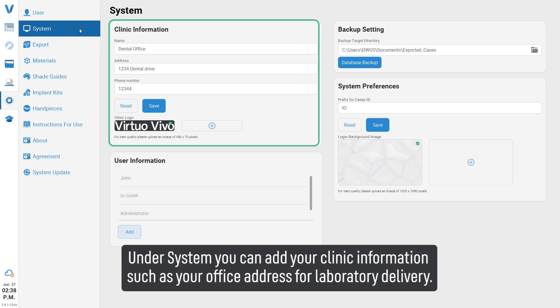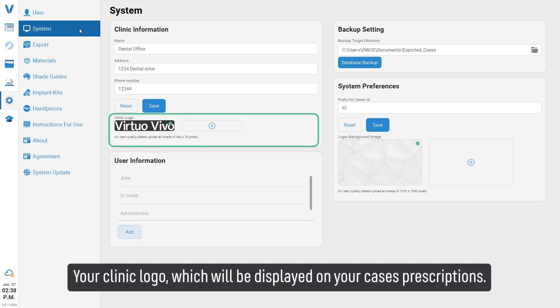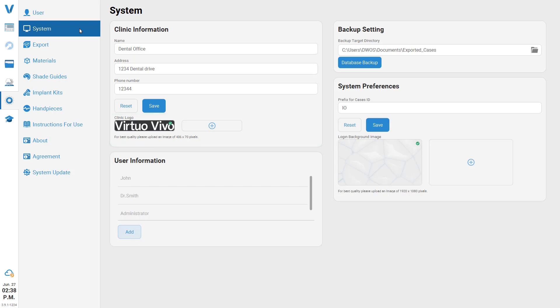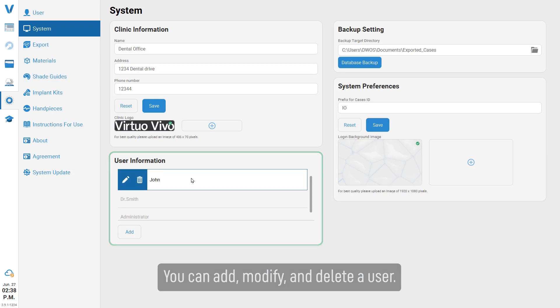Under system, you can add your clinic information such as your office address for laboratory delivery, and your clinic logo, which will be displayed on your case's prescriptions. You can also add, modify, and delete a user.